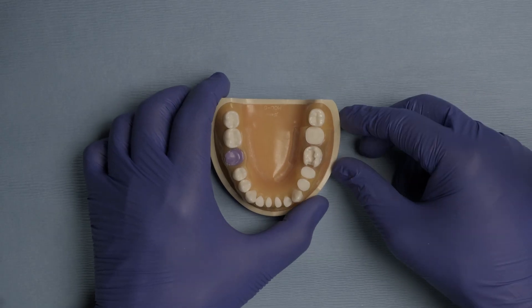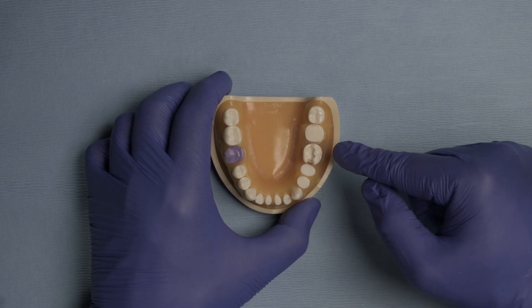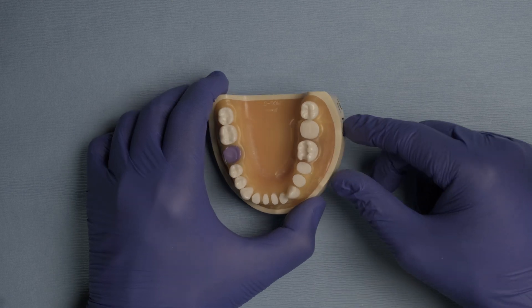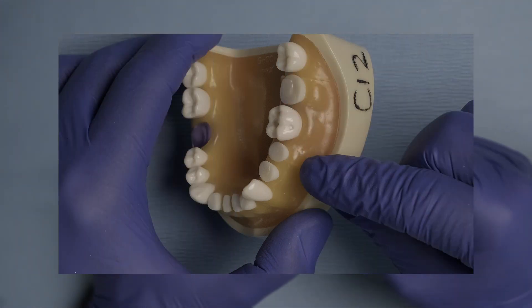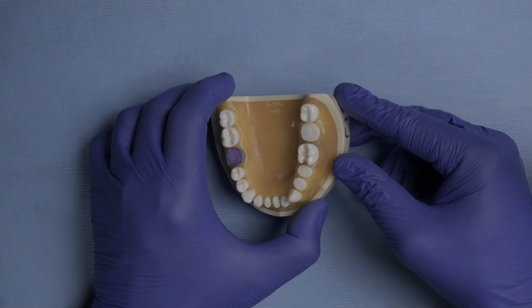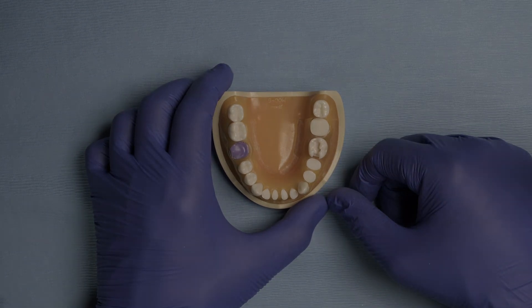For this tip, I'm going to use this portion of the denteform. I'm going to place a W3 clamp on tooth number 19 and isolate all the way to tooth number 22. Tooth number 20 and 21 have been literally sectioned almost to the gingival margin — one very close to it and one slightly above. This is what we consider severely broken down teeth, and I'm going to teach you how to isolate these teeth.